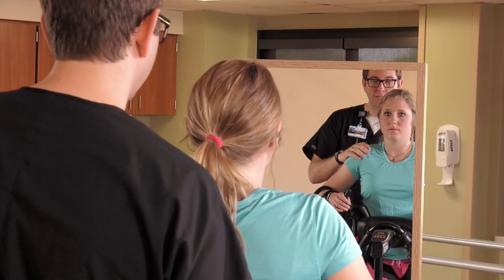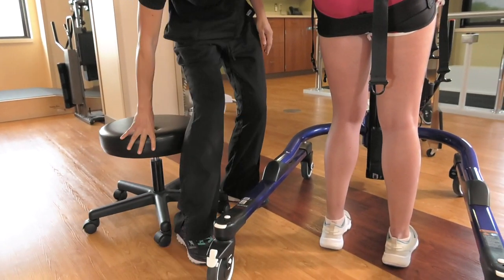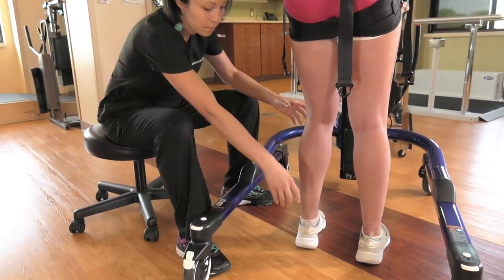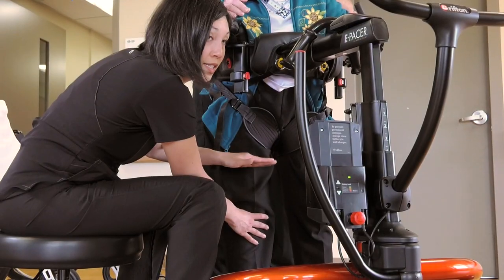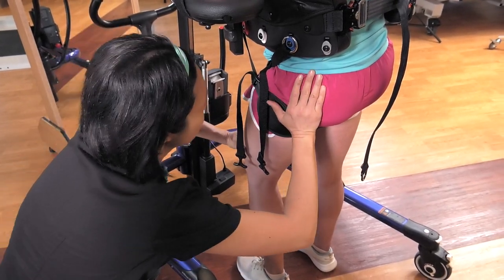The mirror allows her to see if she is shifting away from midline and correct postural errors. Position the patient's feet shoulder-width apart and place a stool to the patient's weak side. Facilitate knee extension with one hand while facilitating hip extension with the other.